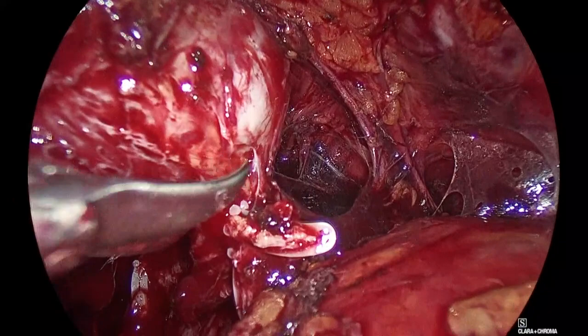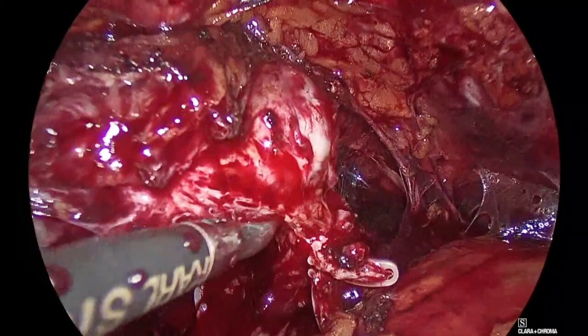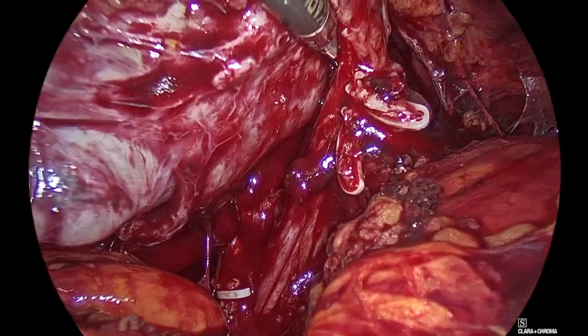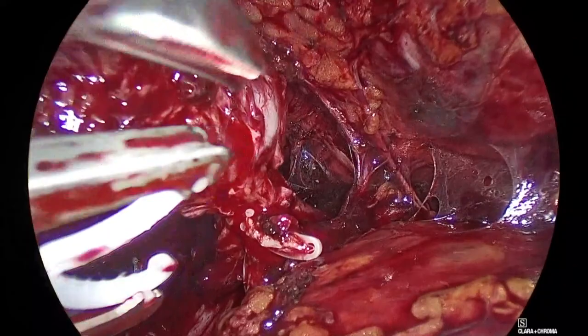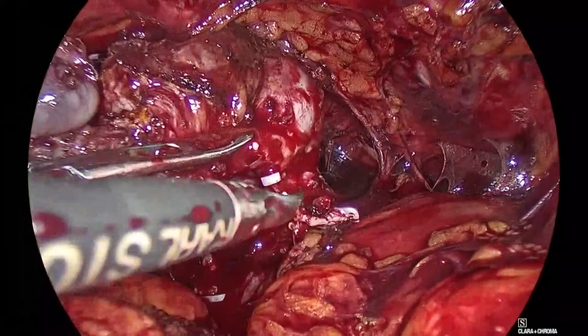There you go. Have you ever had any problems with the migration of the clips through the anastomosis? Yeah, I've seen a couple of them. We've had a couple of clips inside the anastomosis after a couple of months. Two or three cases, yes. It's funny, because the clips seem to be far away, but it's not, you know. Yeah. I've used the Covidien dissolving clip. Yeah. Come in. So I started to use it because of that.